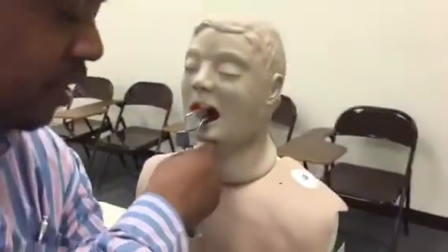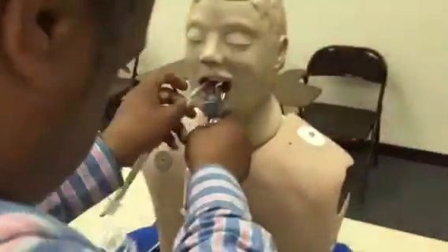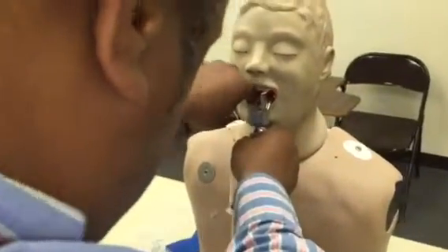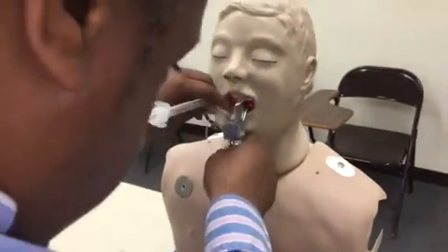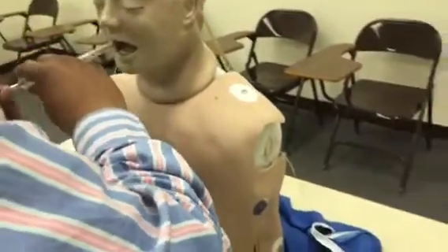While the cameraman steps back, I'm going to put this in. I'm going to get it in between the cords. I'm going to pull out my stylet.